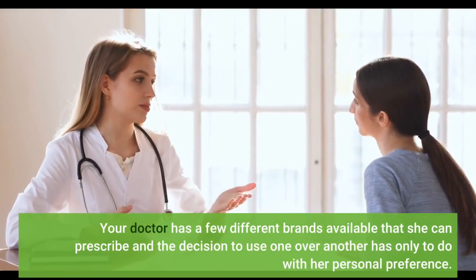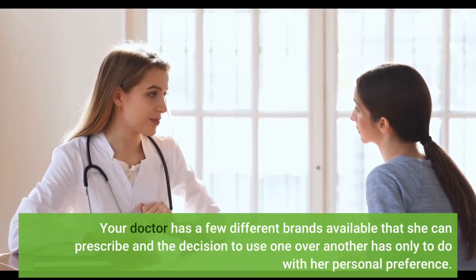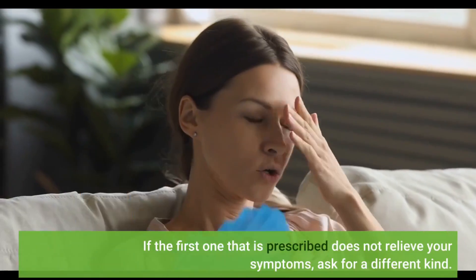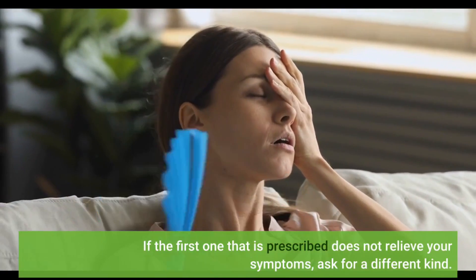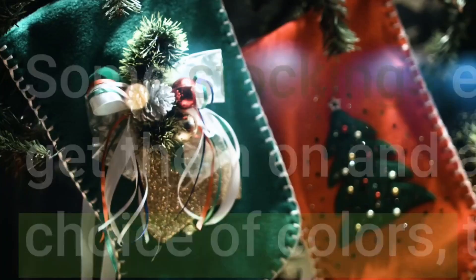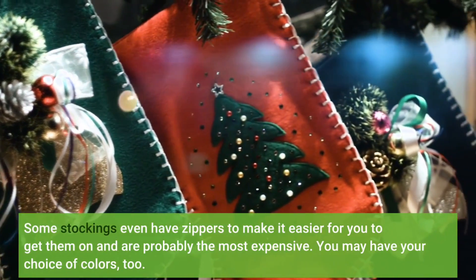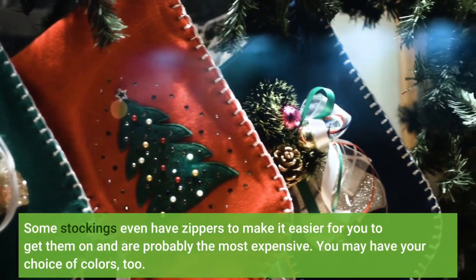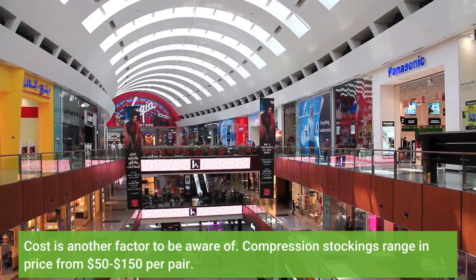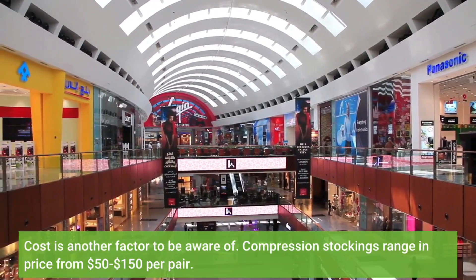Your doctor has a few different brands available that she can prescribe, and the decision to use one over another has only to do with her personal preference. If the first one prescribed does not relieve your symptoms, ask for a different kind. Some stockings even have zippers to make it easier to get them on and are probably the most expensive. You may have your choice of colors too. Cost is another factor to be aware of — compression stockings range in price from $50 to $150 per pair.